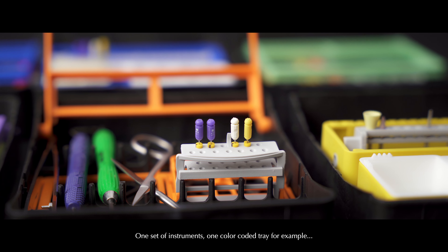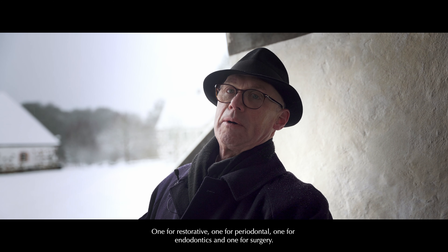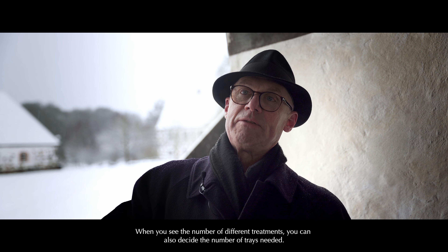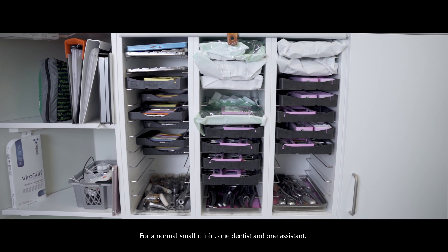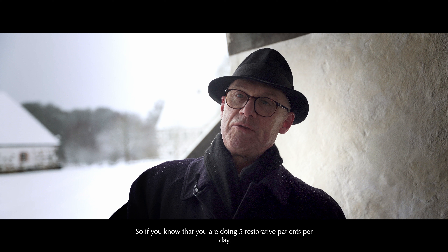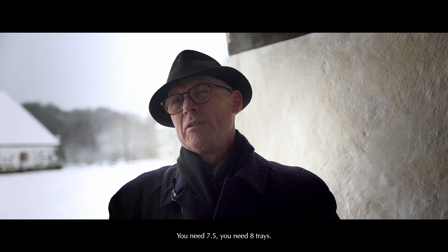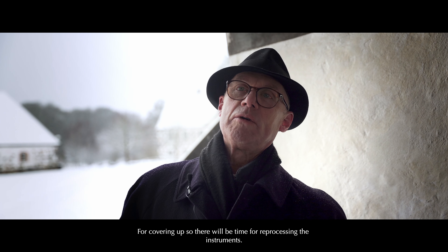One set of instruments, one color-coded tray for, for example, restorative, one for perio, one for endo, and one for surgery. Number four will be to go through the type of treatment you carry out at the clinic. When you see the number of different treatments, you can also decide the number of trays needed. For a normal small clinic — if you are one dentist, one assistant — you need to multiply the number of trays needed by 1.5. So if you know that you are doing five restorative patients per day, you need 7.5 — you need eight trays — to ensure there will be time for reprocessing the instruments.